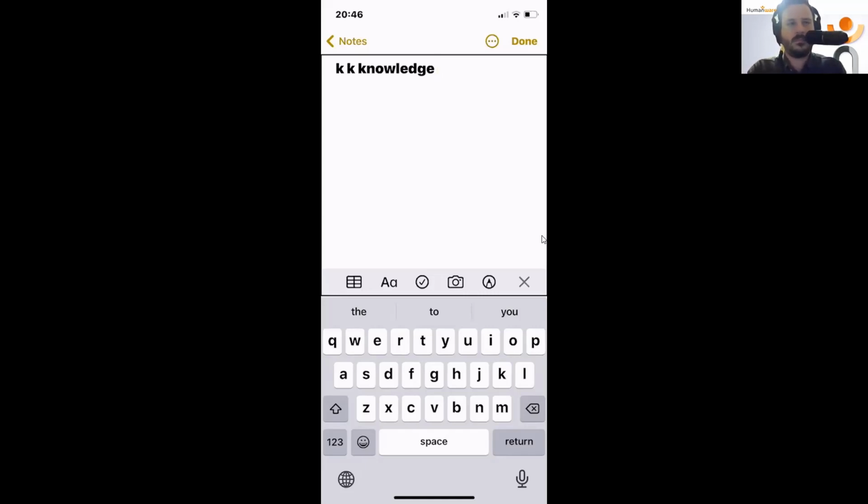So just to summarize, if you ever have any problems typing or reading any Braille, it's more than likely that you're using the wrong Braille code. So just make sure that you can toggle by pressing space with dots 2, 3, and 6. That's your input, and for your output, space with the letter G for golf. And this one's important to everybody because these are standard commands. This is not specific to a Brailliant, or any Braille display; all will utilize these Braille input commands.